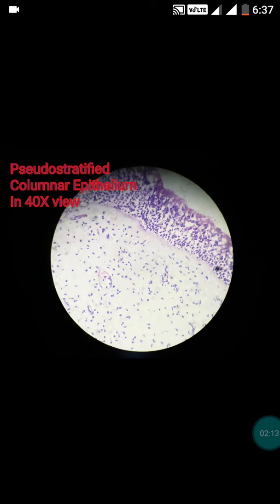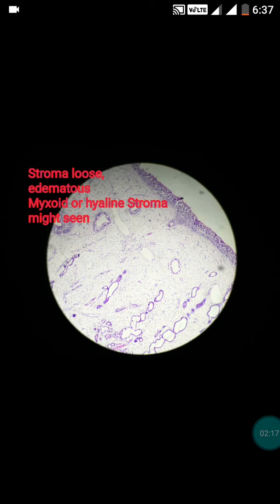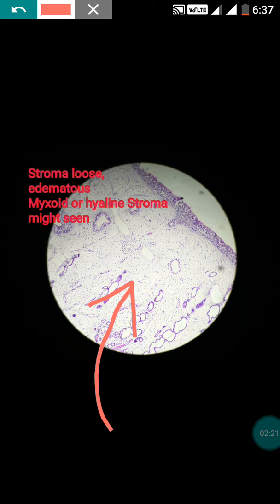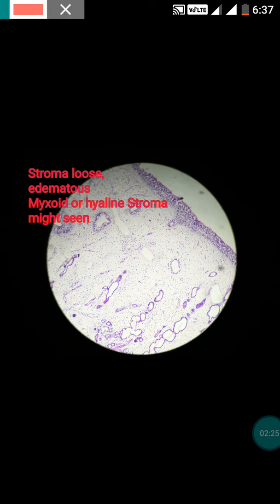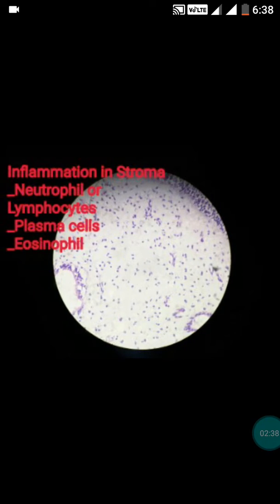The second point: the polyp has a stroma that is very loose and edematous. This is the very loose edematous stroma. Sometimes you can appreciate myxoid change and hyaline stroma as well. This is another characteristic feature of the polyp. We will now inspect the stroma in the high power view.